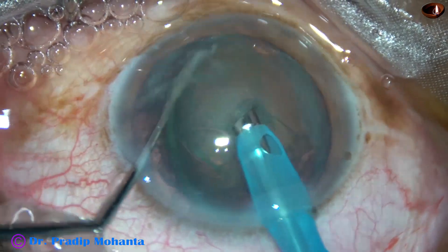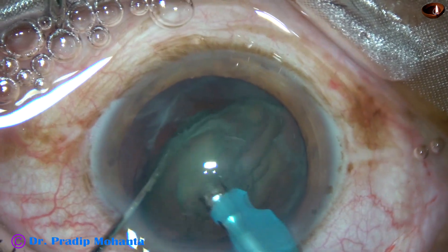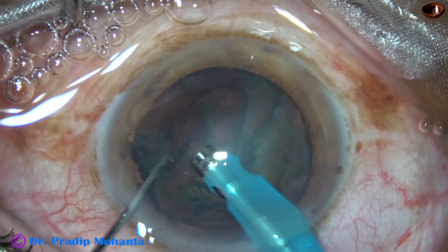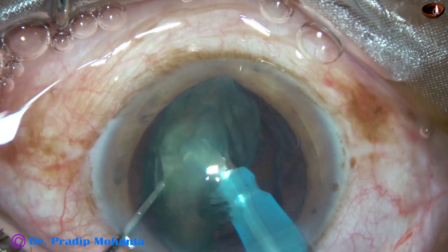And here it is. This is the first cut, second cut, third, and fourth. By four cuts, one portion — the supracapsular portion — is removed.